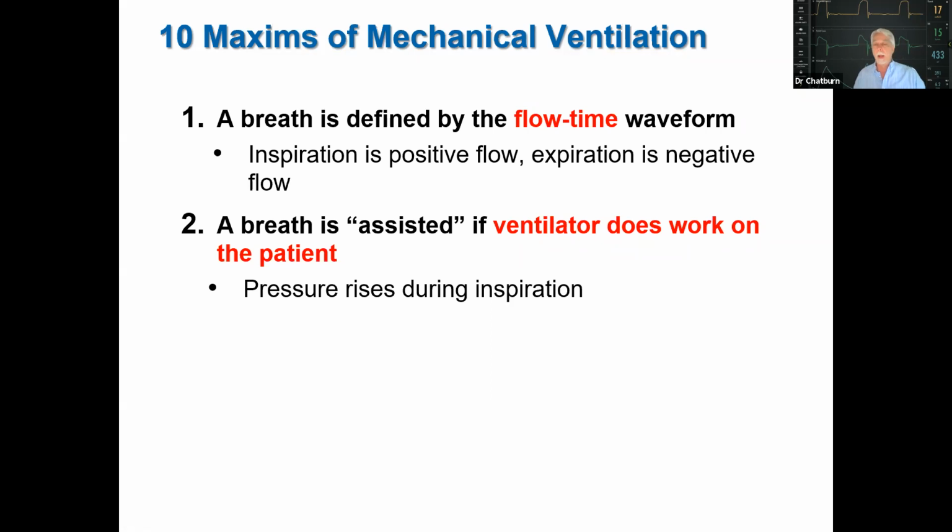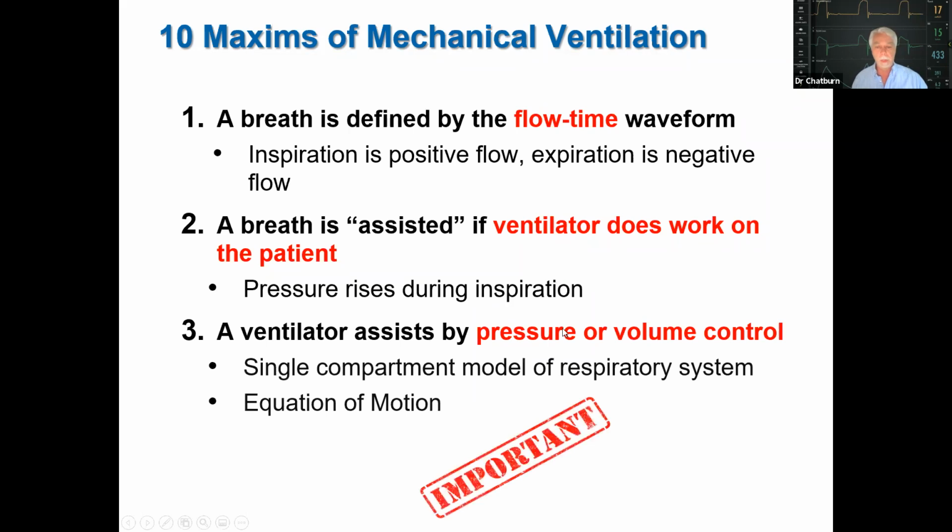Well, pressure rises during inspiration. What's inspiration? Well, it's positive flow. So if you force gas into the patient's respiratory system and the pressure rises, then that does work. So work then is a function of both volume change and pressure change.